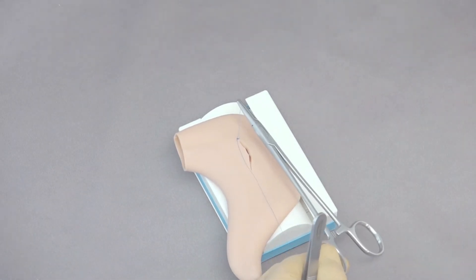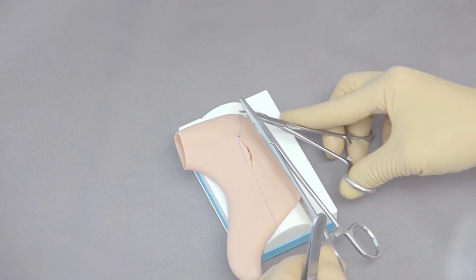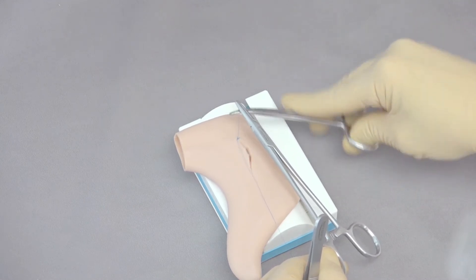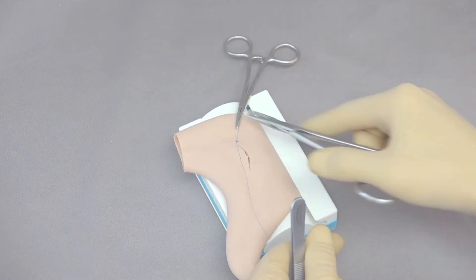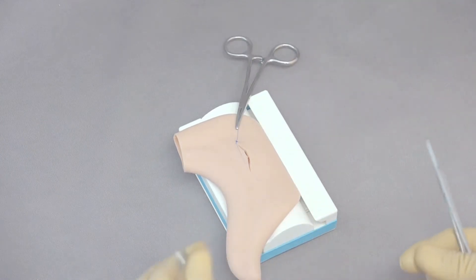Now, in this case, it's a great idea to stabilize this with a hemostat. So we can do that. We'll stabilize it to the end, and that will help to keep it intact, and keep the stomach from moving as much.